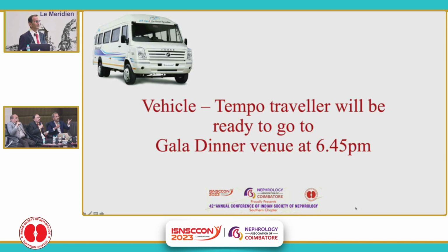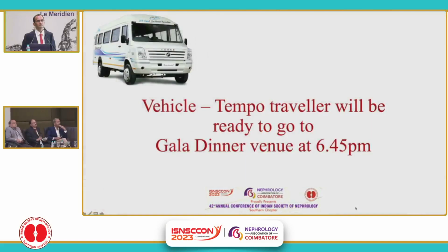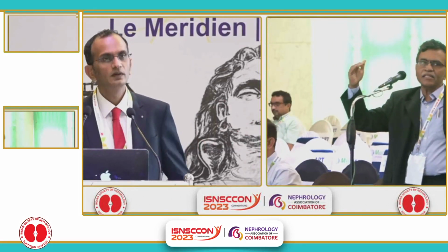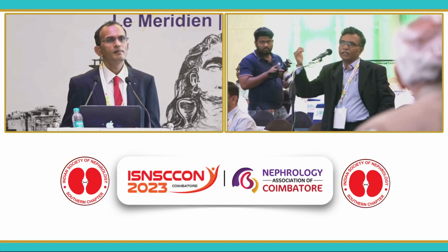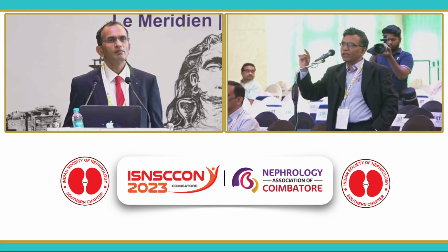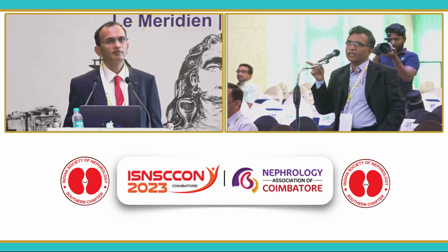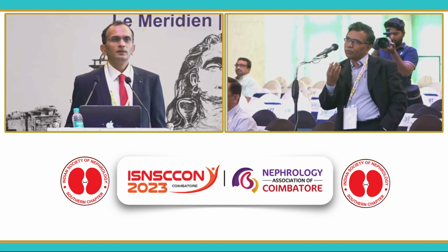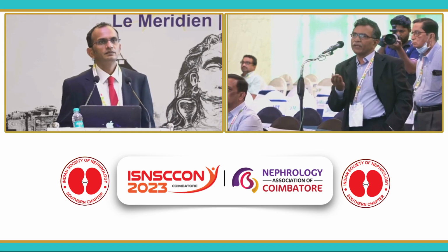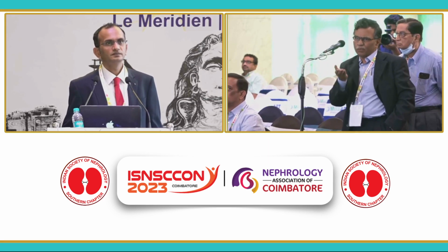Open to audience. Congratulations, Girish. Excellent idea and pilot study. You showed the data pre and post dialysis, but that was very fast. Was there any rise in potassium at the end of the treatment in ultrasound? Because LDH, although statistically not significant, was slightly higher in the ultrasound group. Was potassium any different? And also, being 15 patients, you may not find statistical difference. When you apply it to a larger number of patients, that will be one concern, obviously.